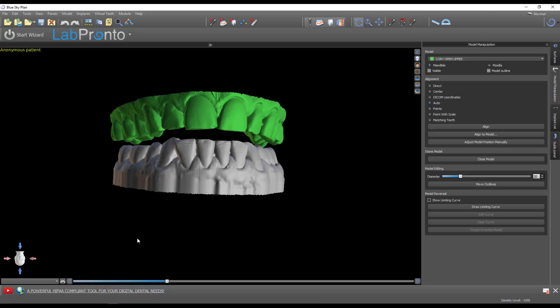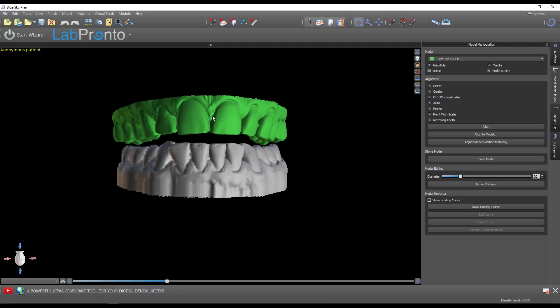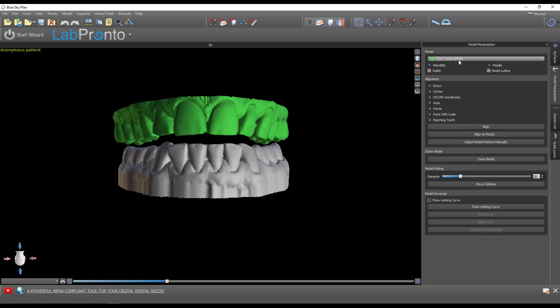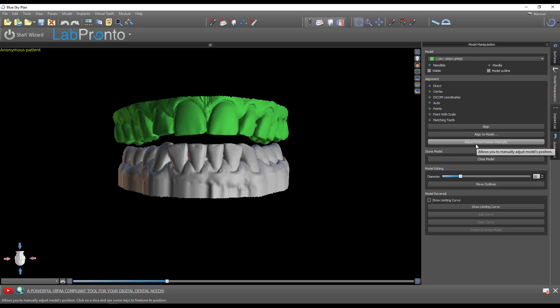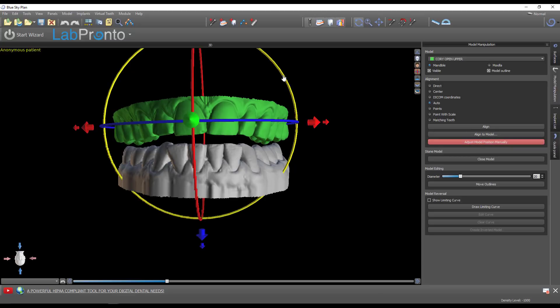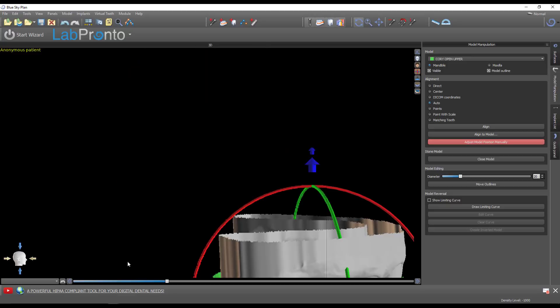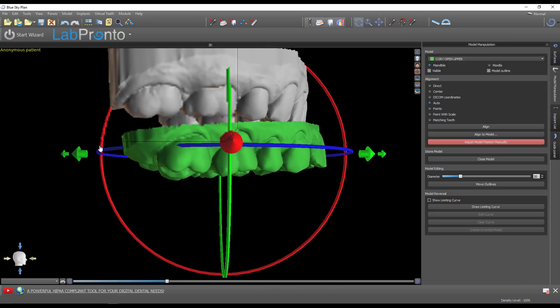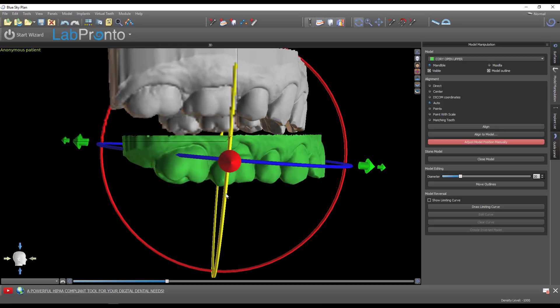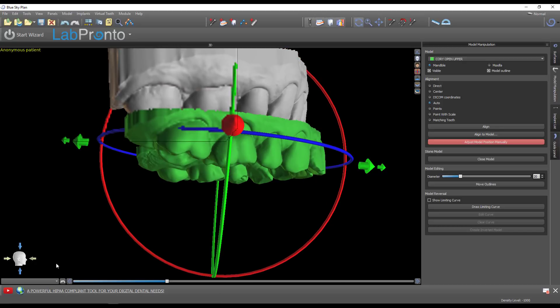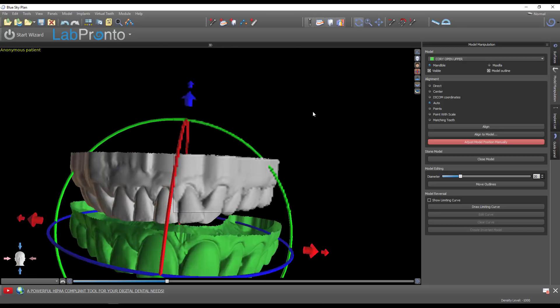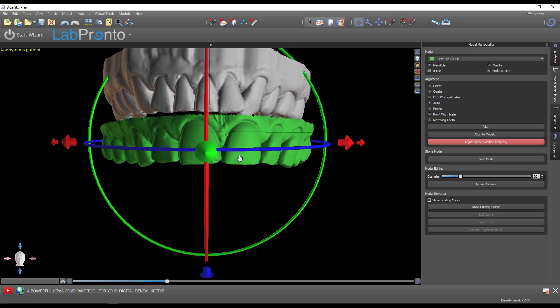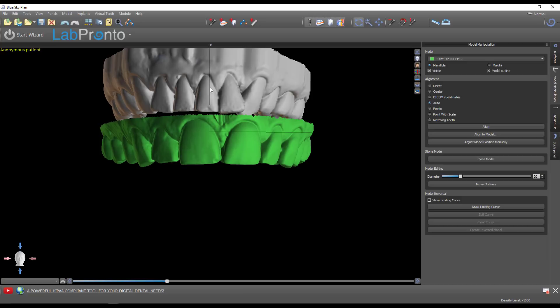The first thing I notice is that my models are oriented correctly to reality, but looking at the skull, they're not appropriately oriented. Always, even in denture cases, make sure your digital models are aligned to the skull. I go into panels model manipulation and adjust position manually. I use the widget to rotate around, paralleling this to the floor basically. Set the cant, and now the maxillary model is aligned in the same orientation to the skull.